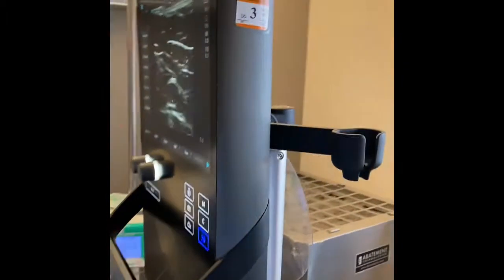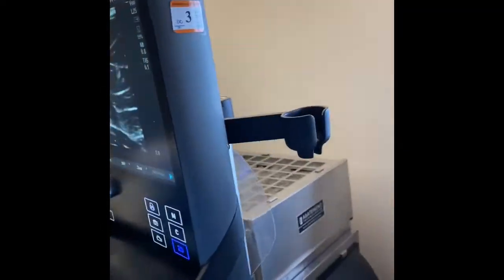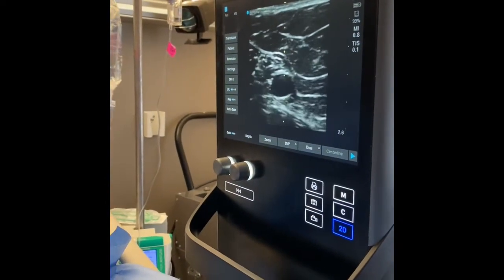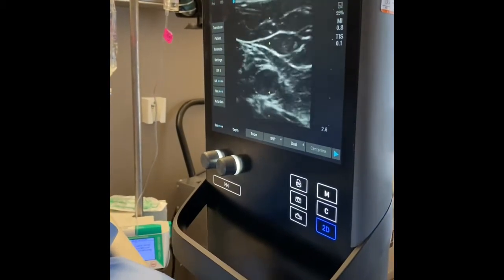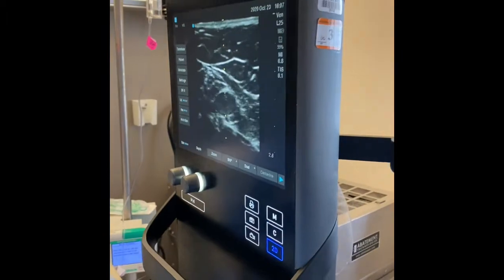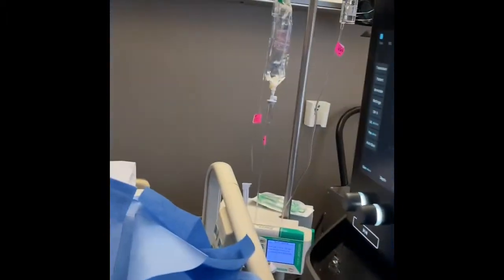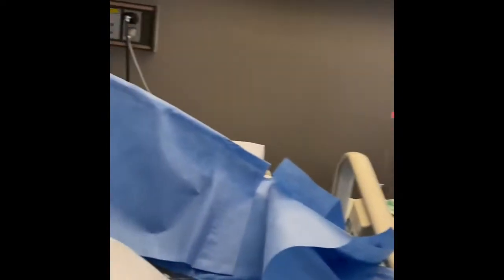Right now he's trying to access — let me get a better view. There's a good vein there. When you approximate the catheter-to-vein ratio on that one, it would probably be like 36%. You know that in Infusion Therapy Society standard of practice, the lower the ratio, the better — it prevents mechanical phlebitis and DVT.